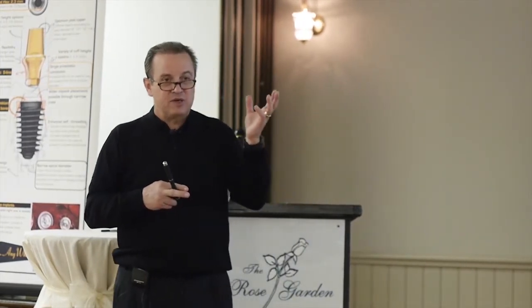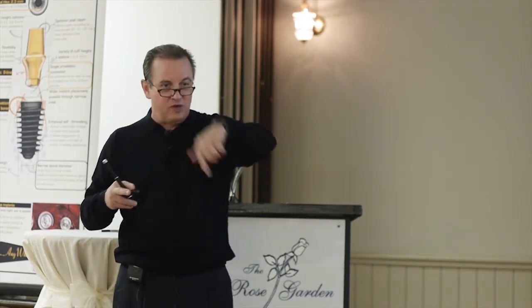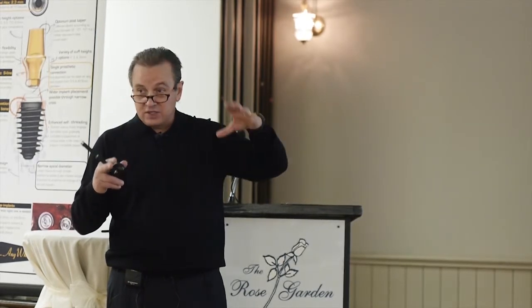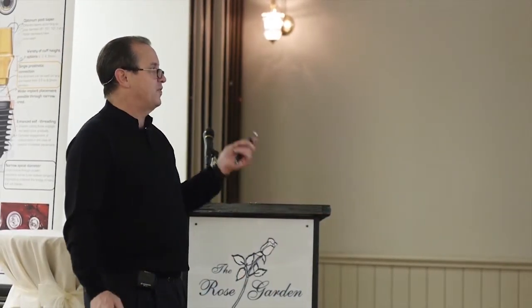And I'll tell you what happened. My partner, probably 6 months ago, had a guide made. It cost about $700. He put it in and he drilled all the holes. And when he got done, 2 of them went out of the lingual plate. You know, and I mean, he's a good clinician. I don't know what happened, but it was not a good day. Not a good day.